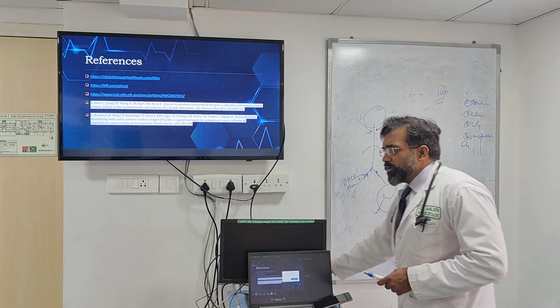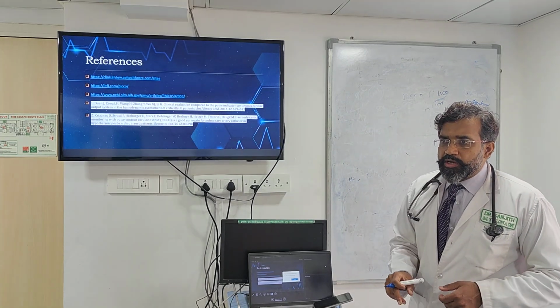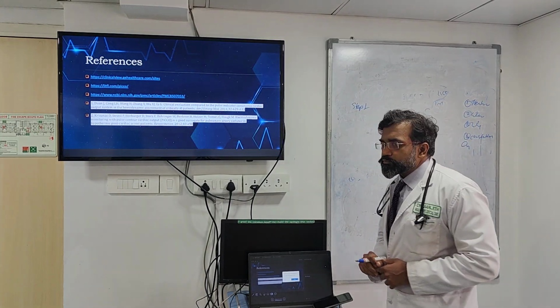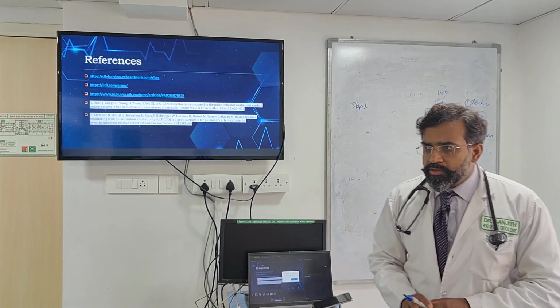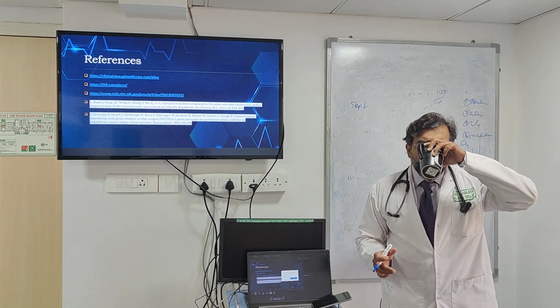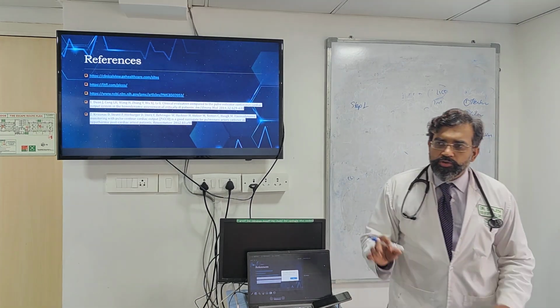So let's see step 1. What is step 1? So I want to do thermodilution. Niharika calls me up and says, sir, patient. I ask, what are you going to do? Step 1. First consent. That is already done. Let's not go to nursing issues. Step 1 here is not to put the catheter but to do the thermodilution. First we'll connect the catheter to the thermistor. It's already connected. Everything is on. You just need to do thermodilution.